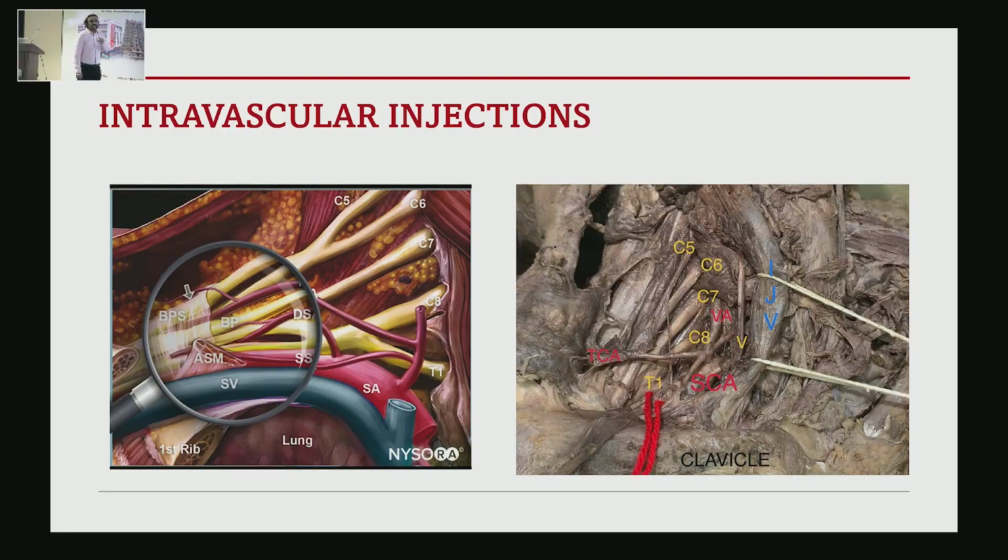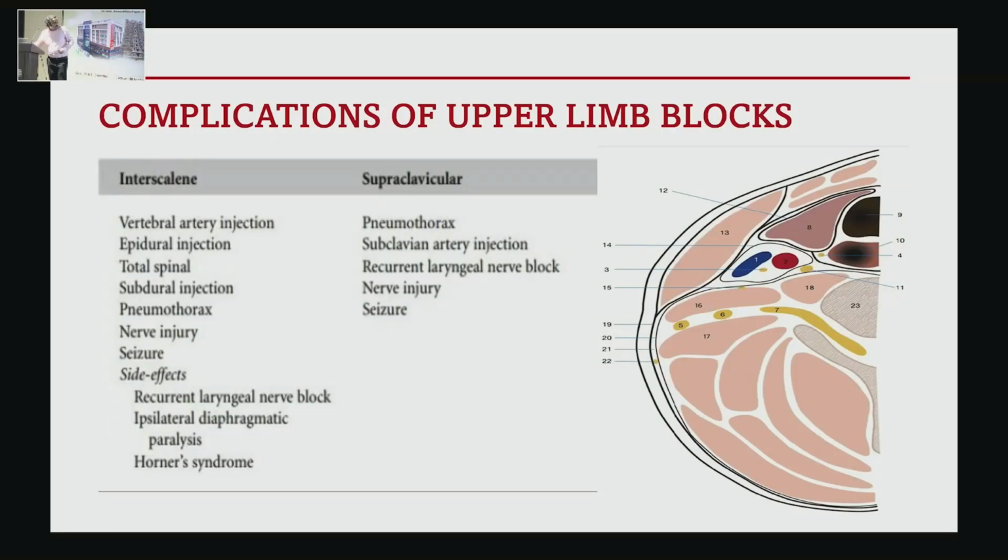As Ganesan sir was pointing out, even 2 ml of local anesthetic will cause seizures. During my postgraduate days in Madras Medical College, every week we used to have a case of seizures while doing interscalene block. So be aware of this very, very important complication. Always put a color Doppler and rule out that it is a vessel before you proceed with the block. Complications of interscalene block, this is what we have been discussing. You see, there is a long list. It's not that you should not do this block.